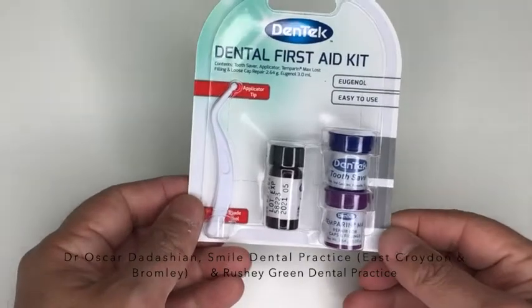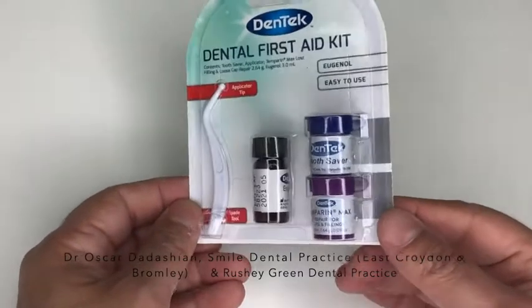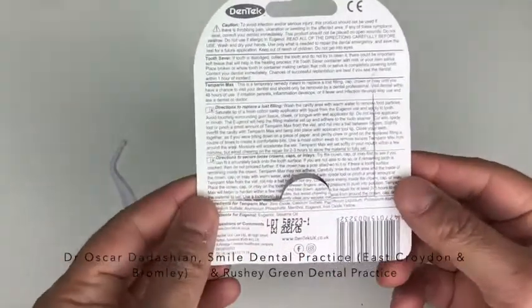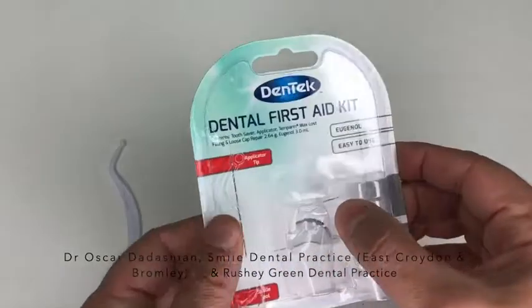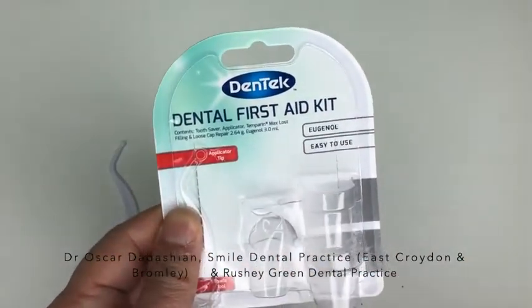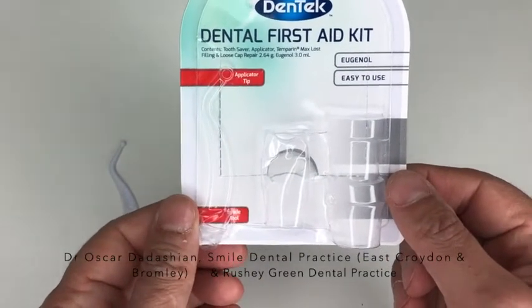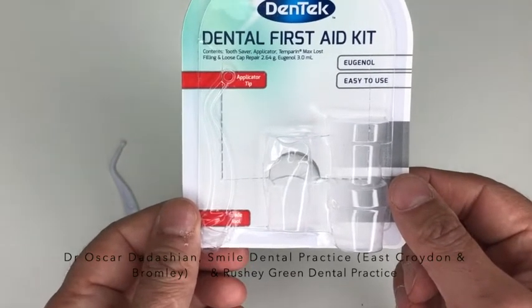So I picked up this dental first aid kit from Boots. It's very straightforward. Please take your time and read the instructions at the back. It's very self-explanatory, and the instructions are very good. Please make sure if you're allergic to eugenol that you don't use this. If you have a throbbing tooth with a swelling next to it, that's also the sort of tooth you don't want to use any temporary on top of.